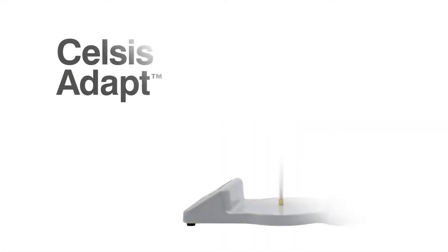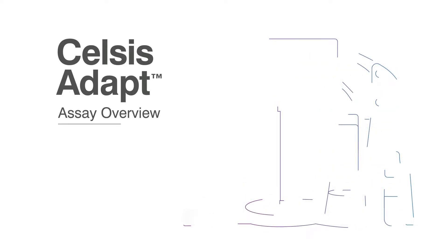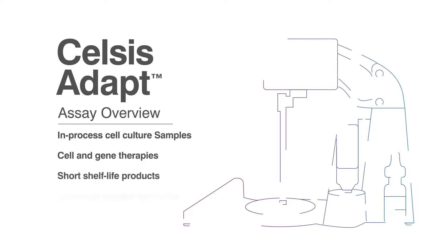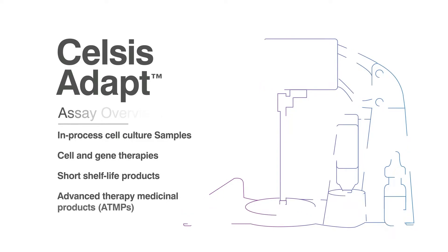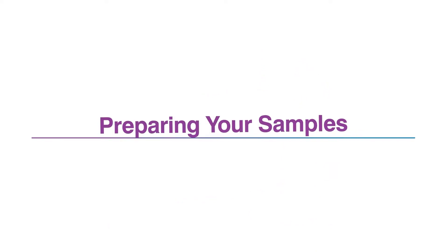The Celsis ADAPT cell assay prepares samples for use with Celsis ATP bioluminescence rapid detection. It's been purposely designed to test cell-containing samples such as in-process cell culture testing, or for the release of cell and gene therapies, short shelf life products, and ATMPs. Start by preparing your samples according to your standard operating procedures.